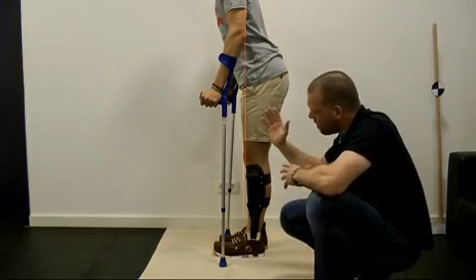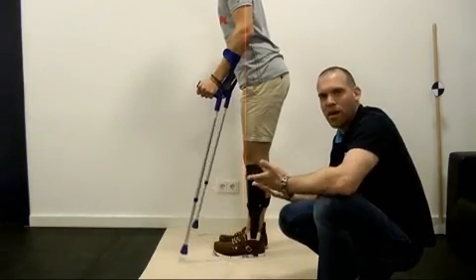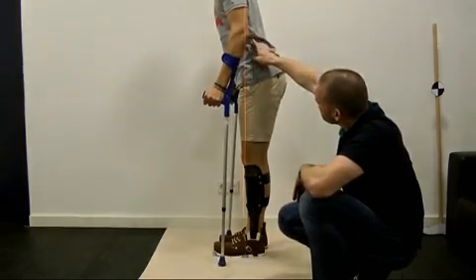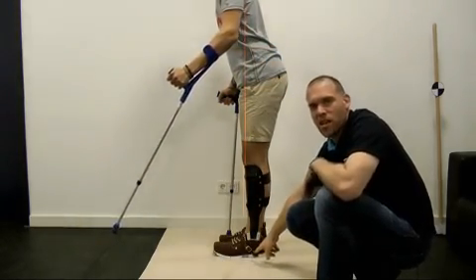The question again is if Henrik can stand at this moment. Yes, absolutely, because the plumb line from the body's center of gravity falls over the marked area on the foot, and therefore he can achieve stability in standing.